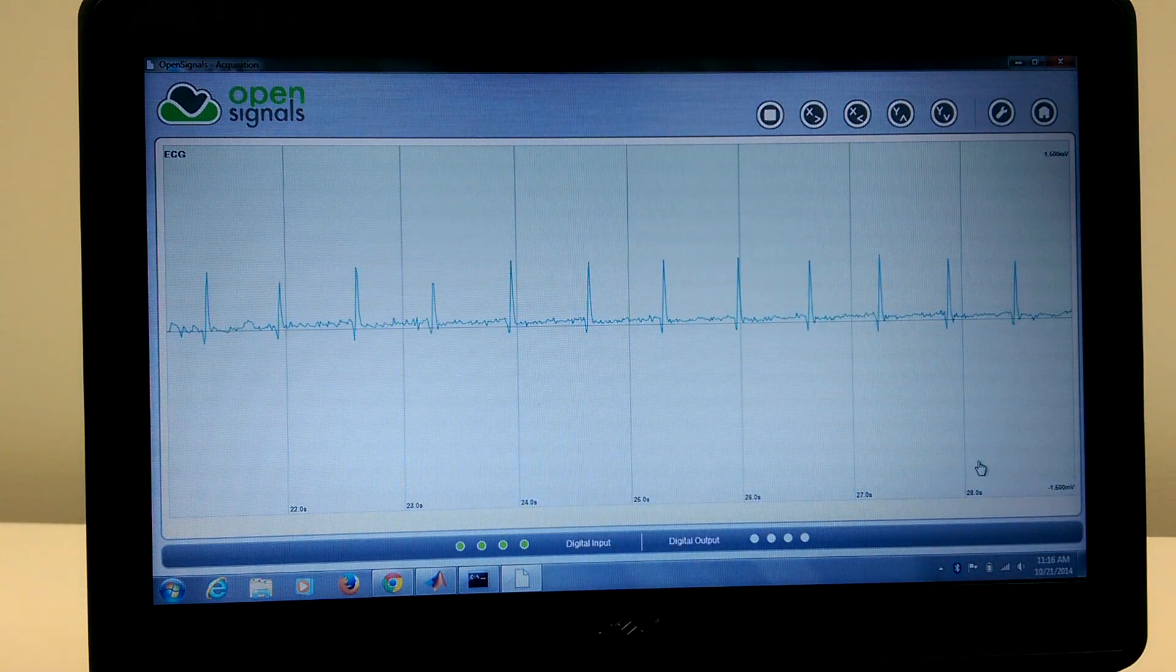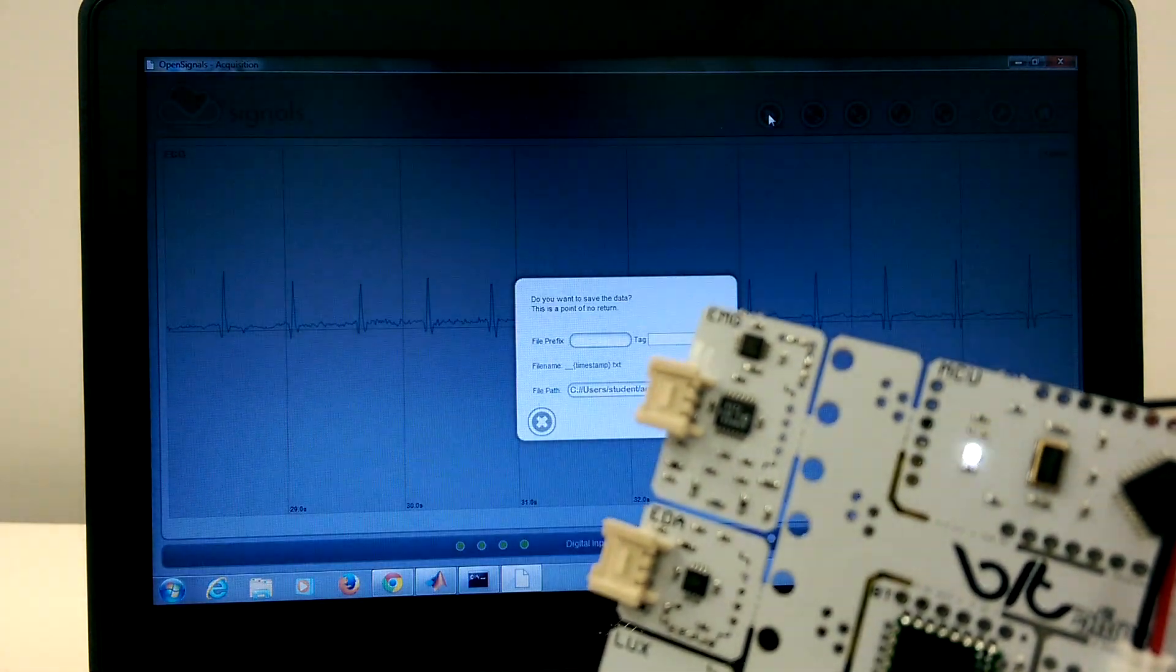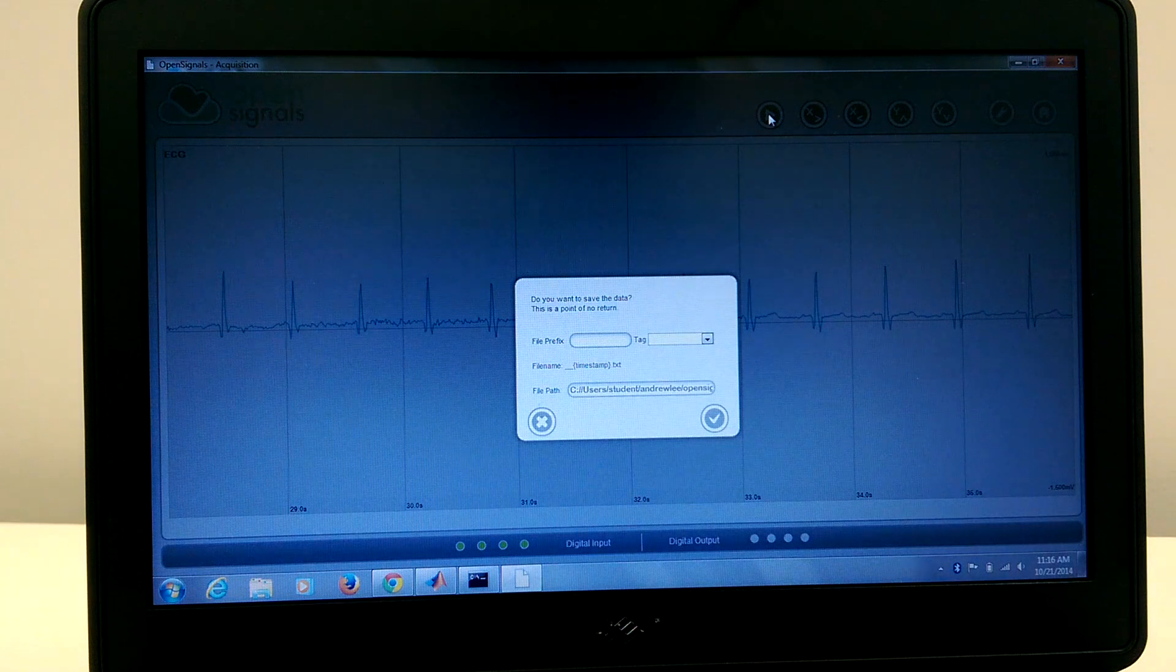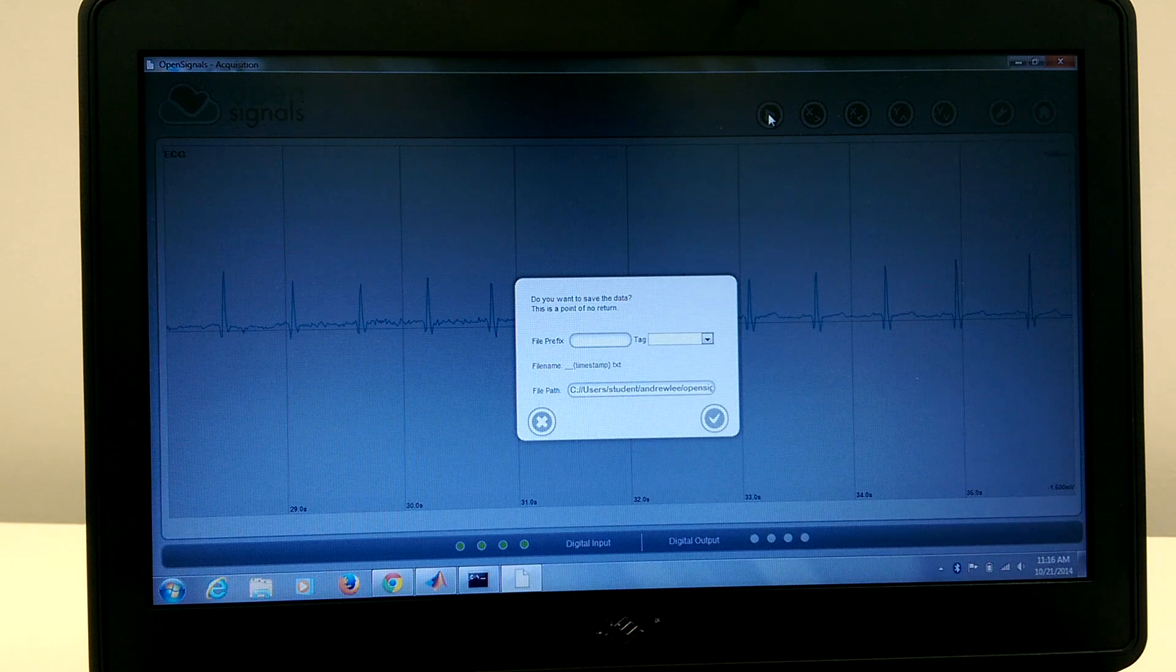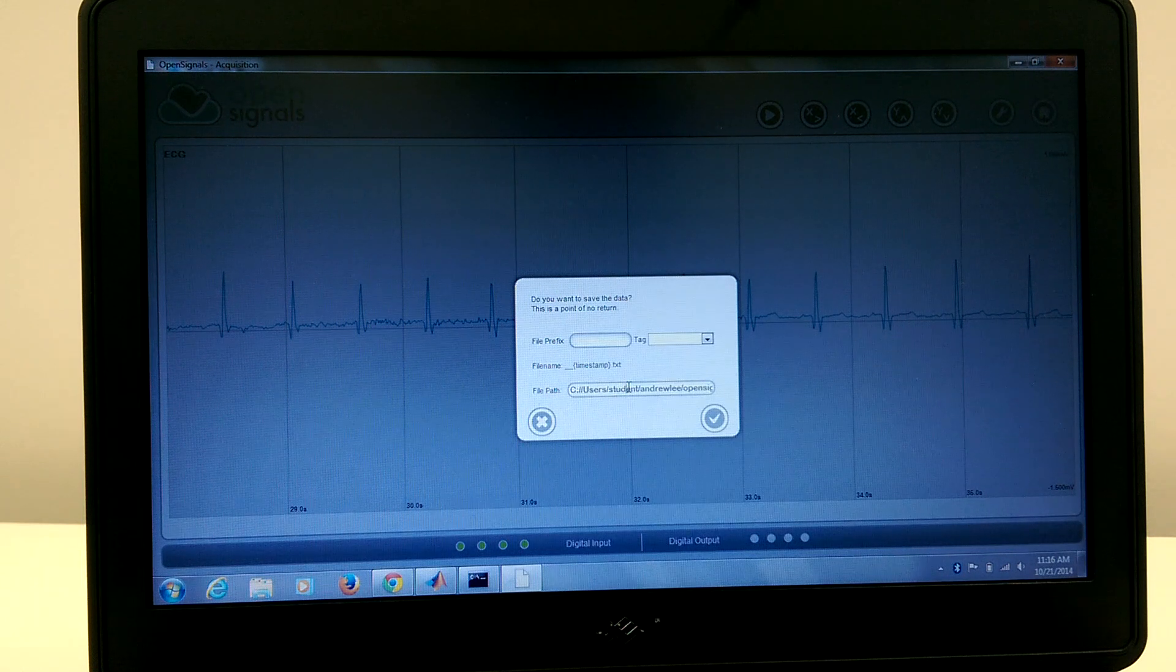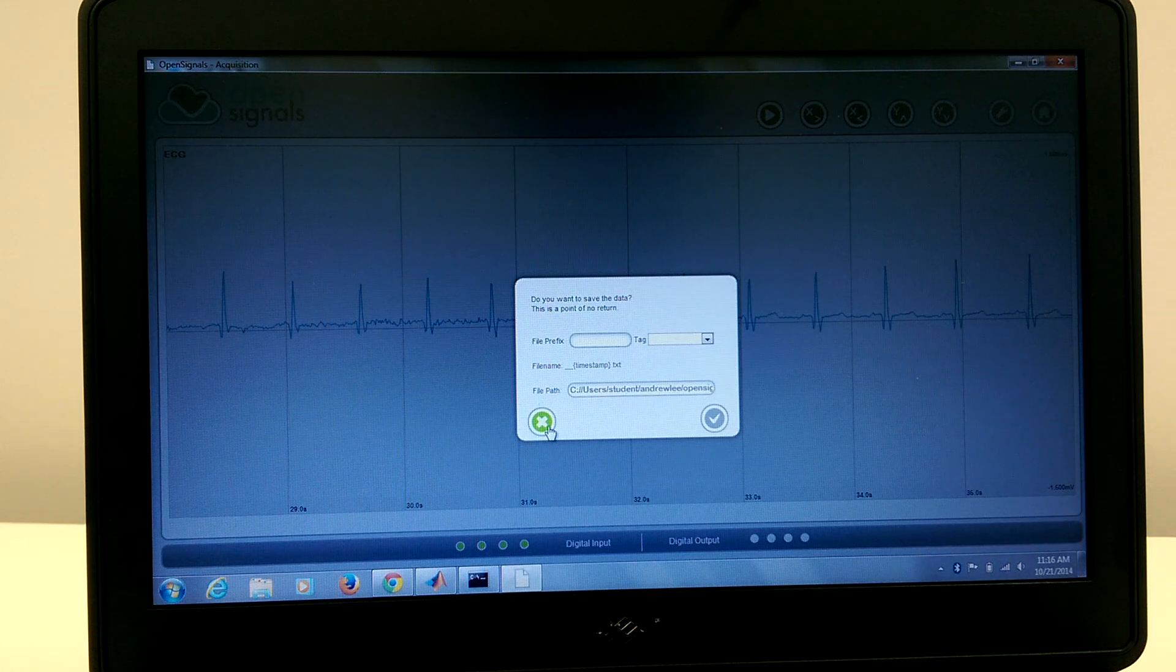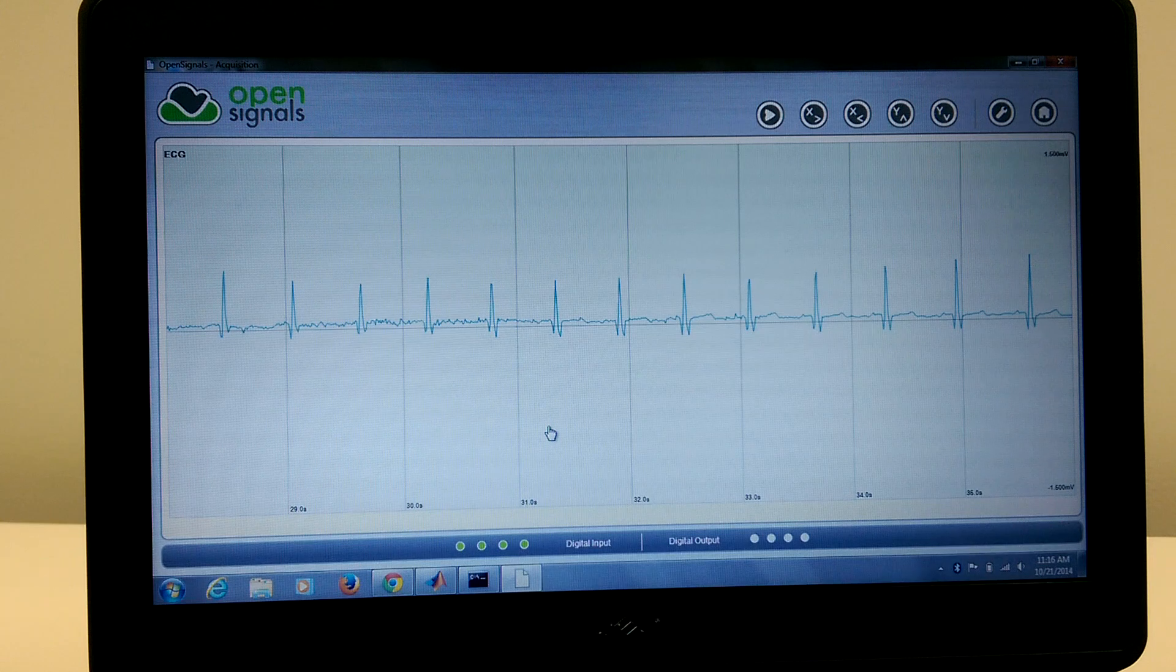So once we're done collecting, however, we just quickly go to here, click the stop button, and we'll see that the device stops blinking as quickly, and we now know that it has stopped. Here we now have the option to save the file with any name we choose, in the path that we choose. You could use the default one that you had set up already, or you can create a new path. We're not going to save today, but that's always an option, and when you come back to it, it will be extremely helpful.